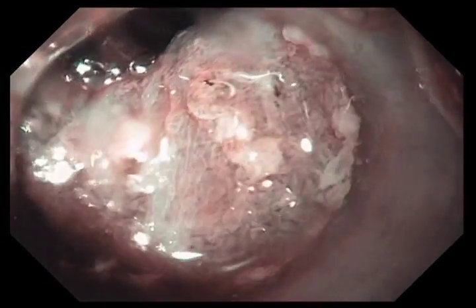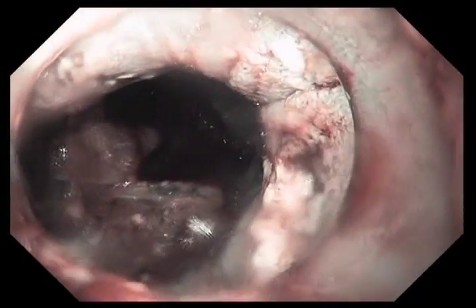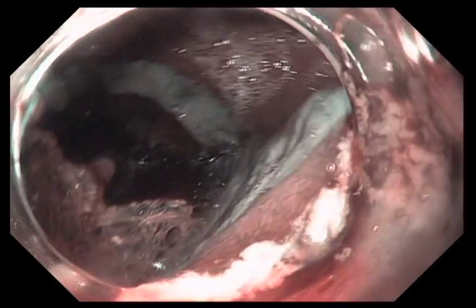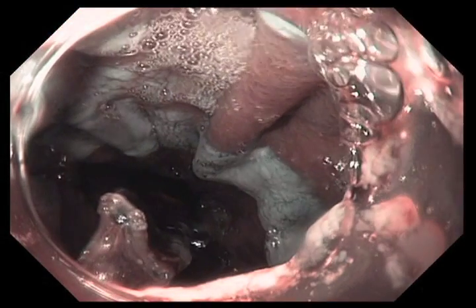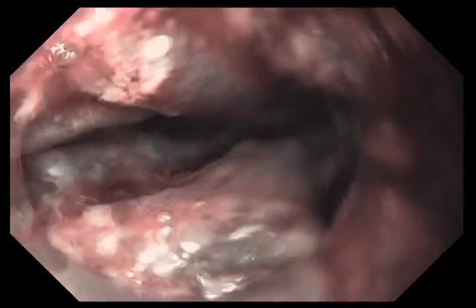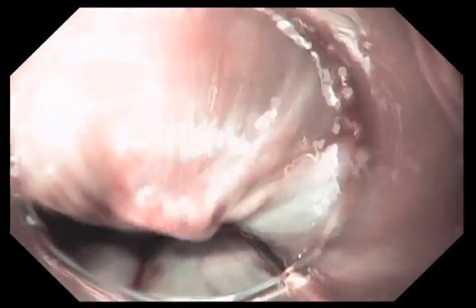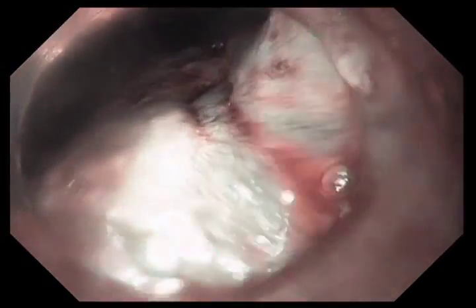The key to this technology is to ablate or necrose tissue to a very precise depth — we don't want to go too deep and we don't want to go too shallow. With a tortuous esophagus and this balloon, you can see there are some areas which did not get fully coagulated. So inevitably, you have to come back after a balloon treatment to touch up or spot weld those areas.